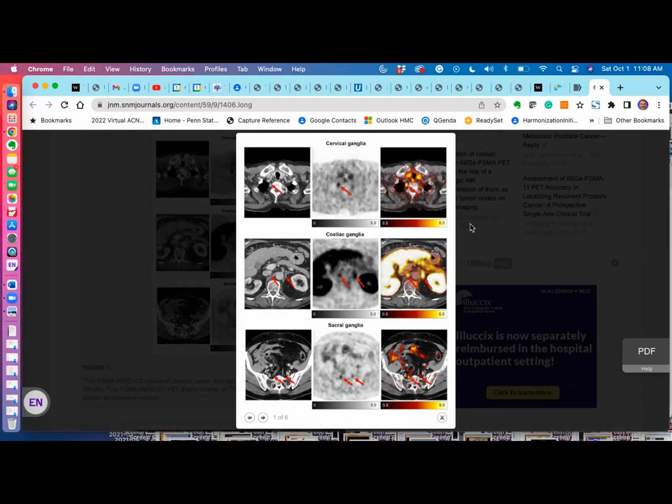Because it's in the wrong place. I mean, that's the easiest answer. Right, it's not near the neural foramen. Please look at this image. You think it was that different? Yeah, it was further down posterior, Dr. Tulczewski. But the ganglia go down posterior. There is a rundown of ganglia. That would not be an easy answer. I understand hoping to have an easy one, but it isn't.